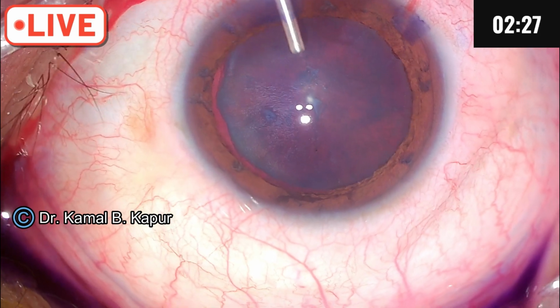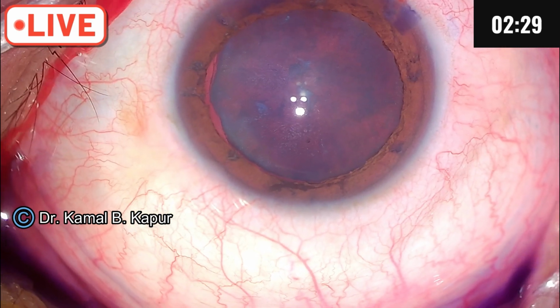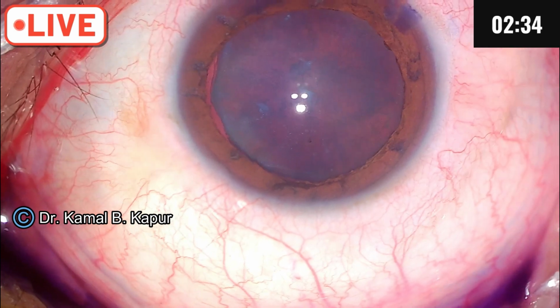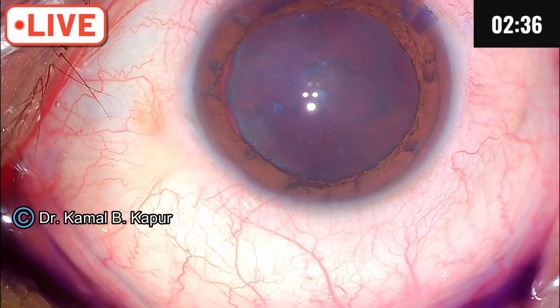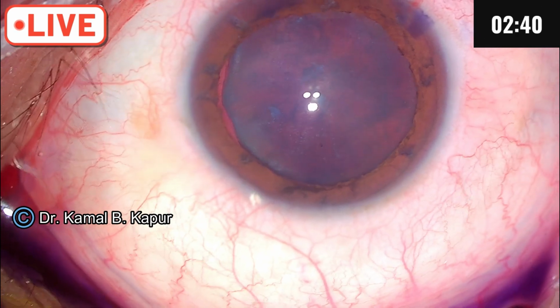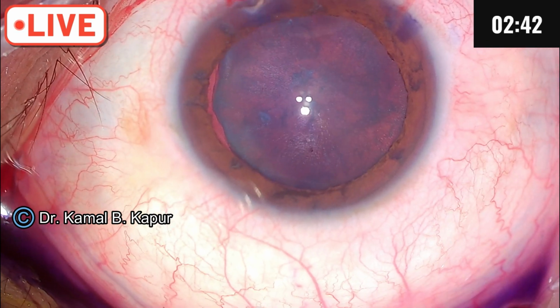So needle. Now the trick is always to have a slightly broader rim of Capsulorhexis in the area of subluxation. Now we will start with making our Capsulorhexis.